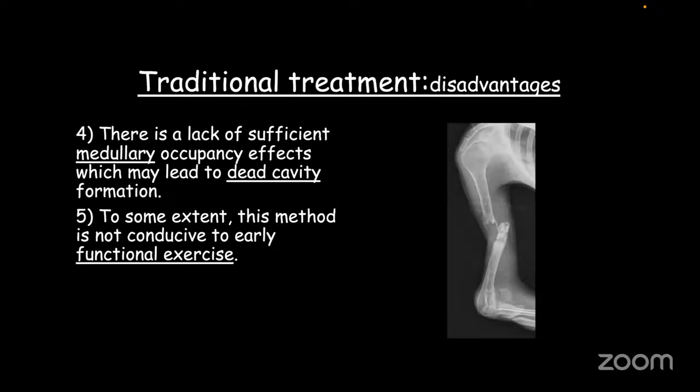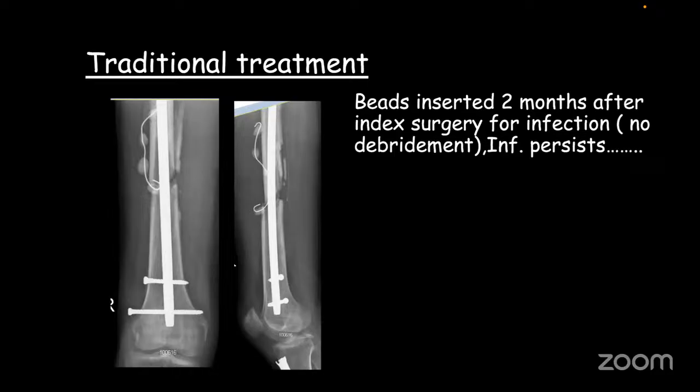There is a lack of sufficient medullary occupancy, which may lead to dead cavity formation inside the medullary canal, and that is the reason the infection was never controlled when fixators were used. To some extent, this method did not allow functional exercises. That means the patient could not use the arm or the lower limb effectively during the treatment.